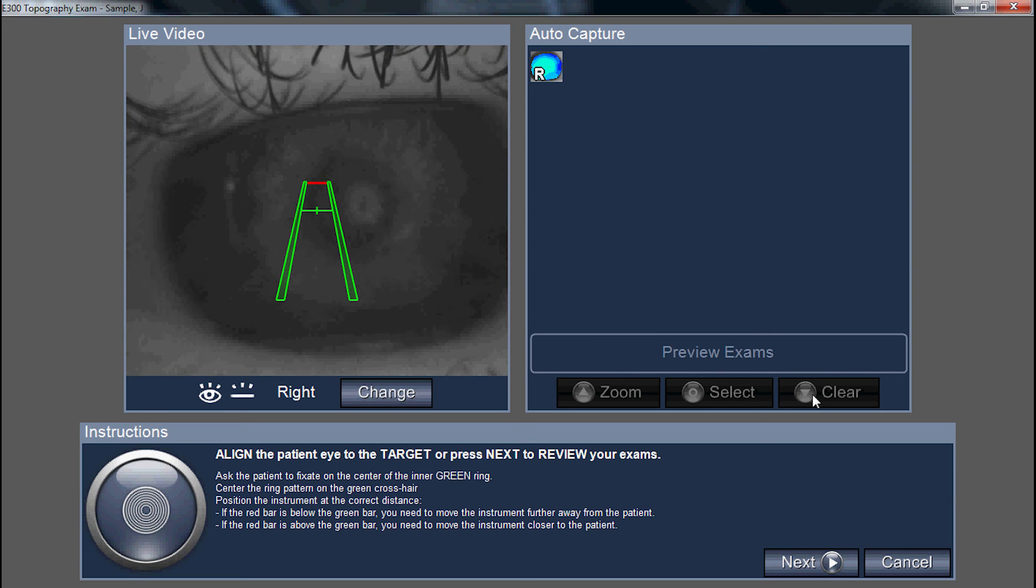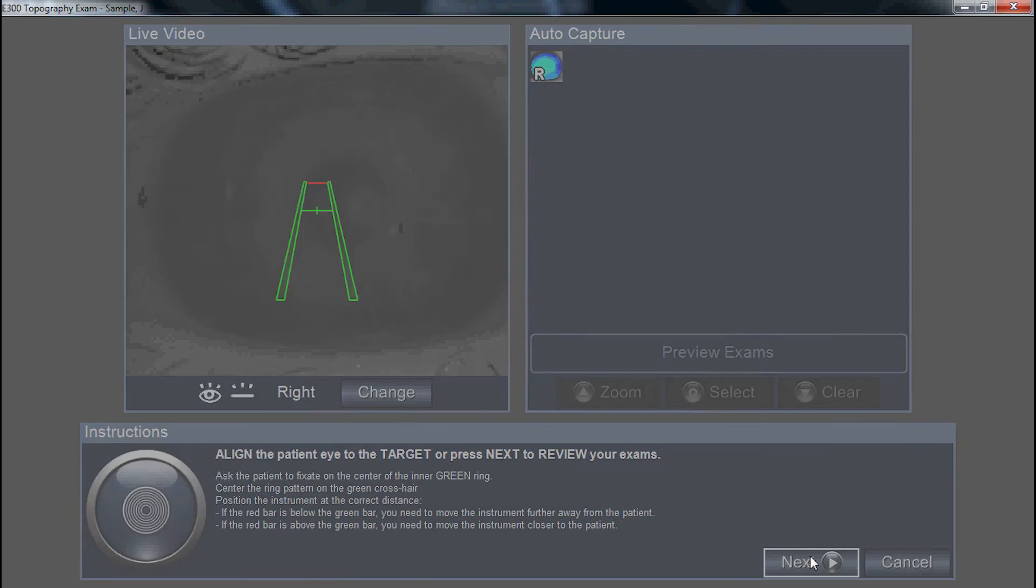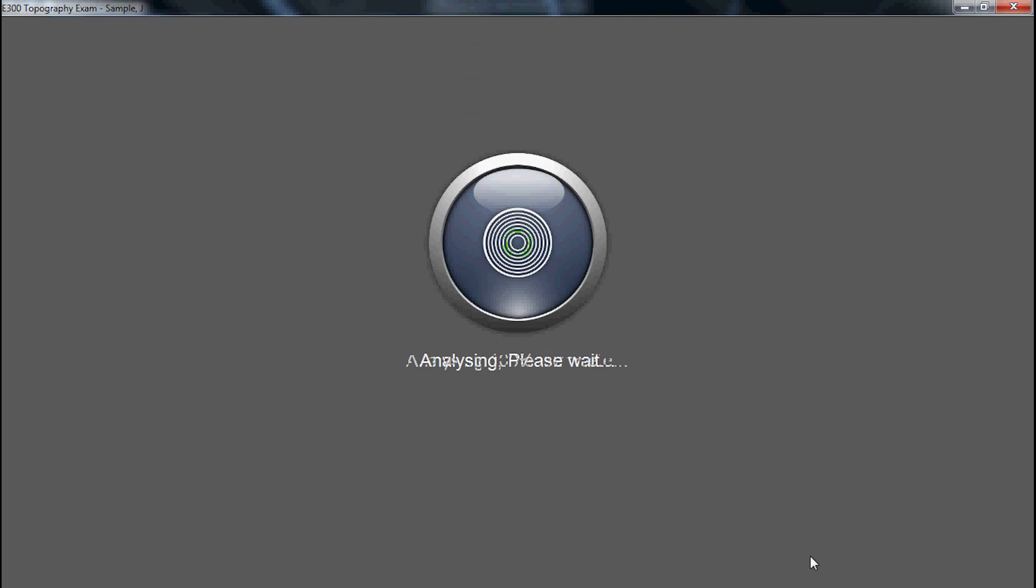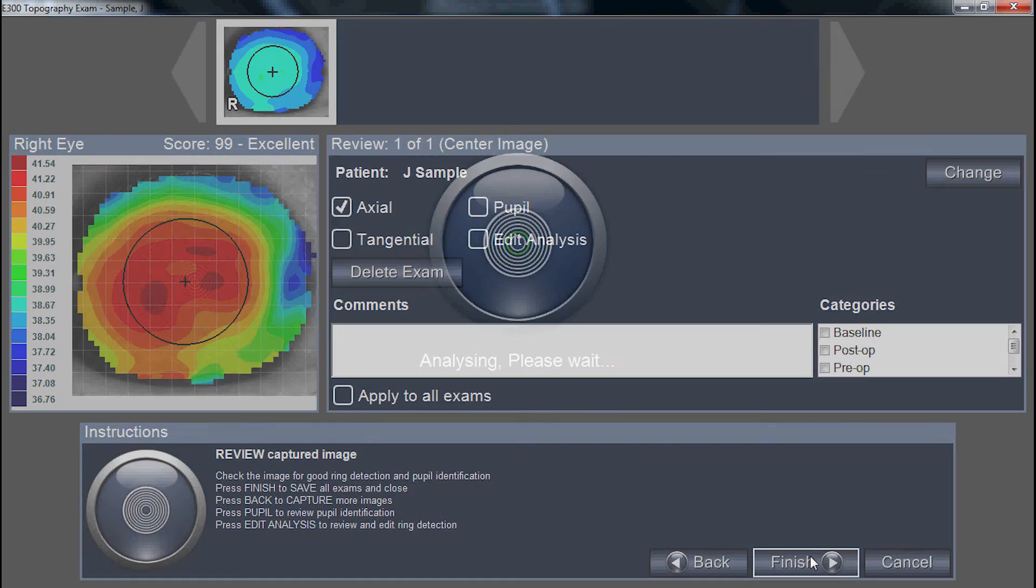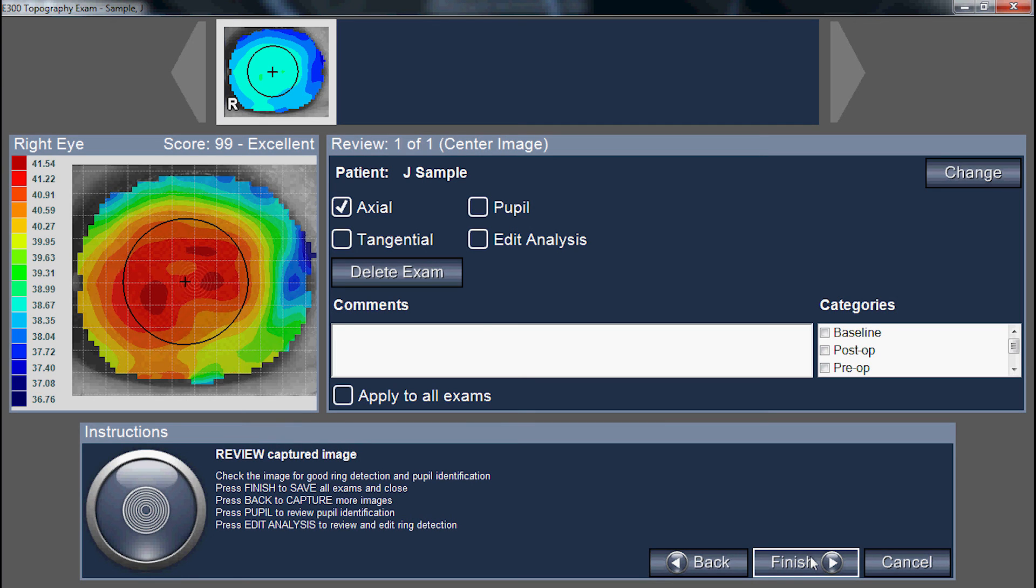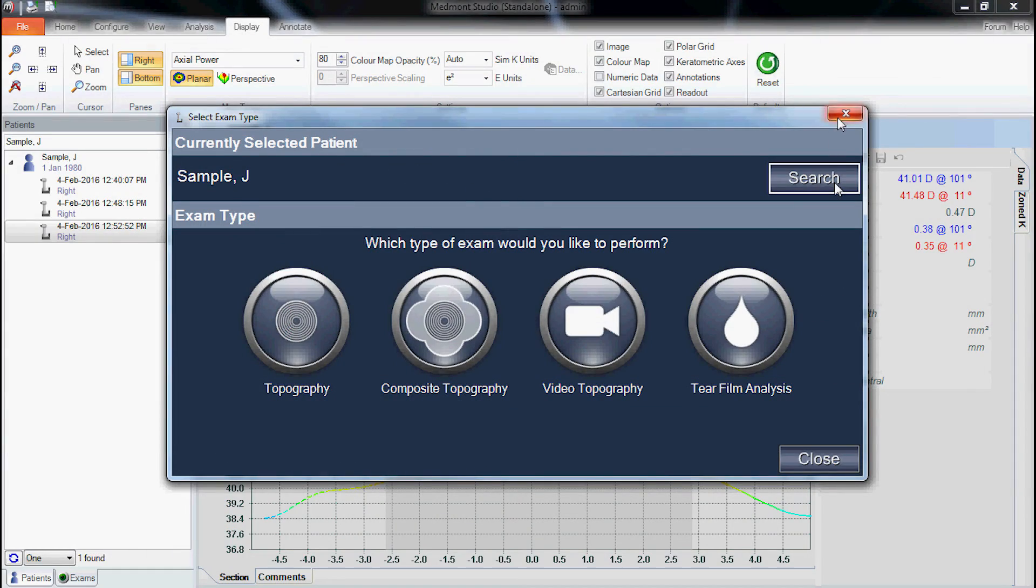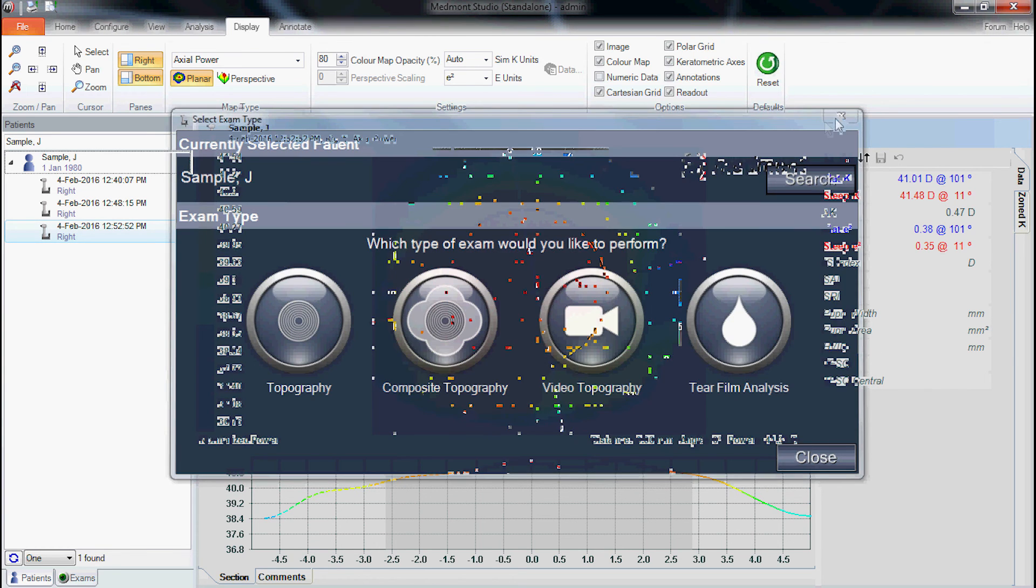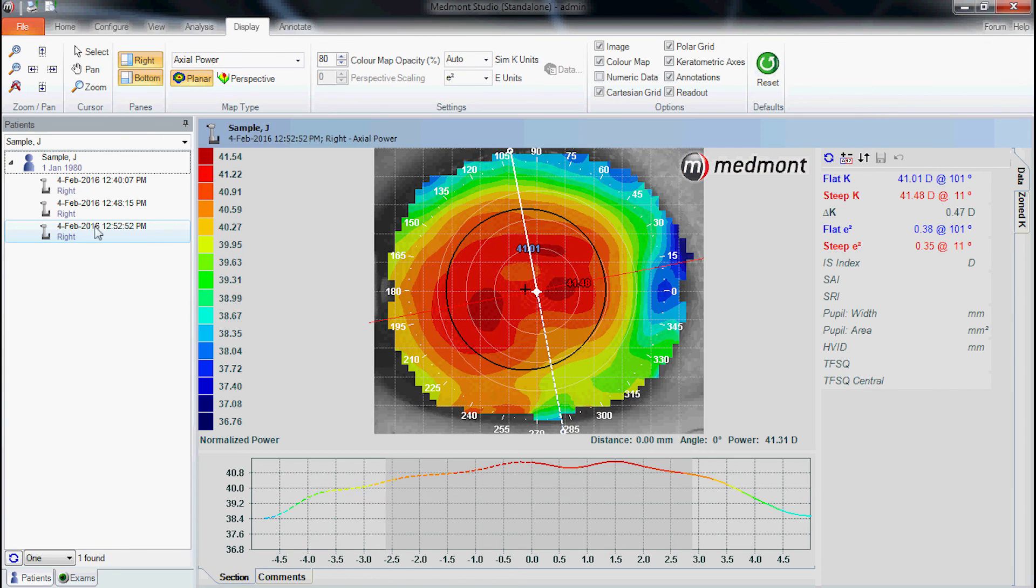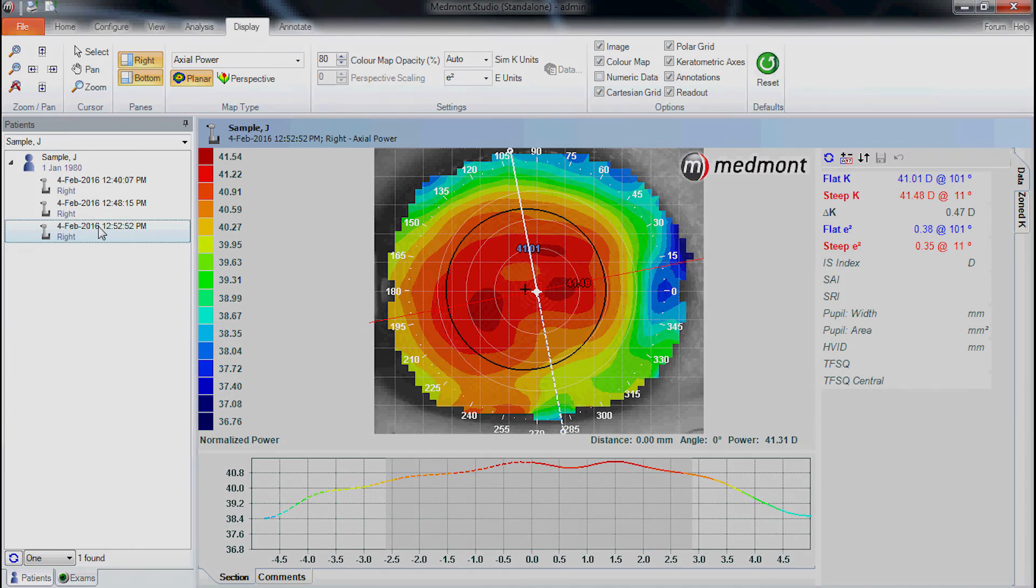If you're happy with the captured images, click next and finish. This will save the images to the patient file. We can close down the image window and see our captured topography.